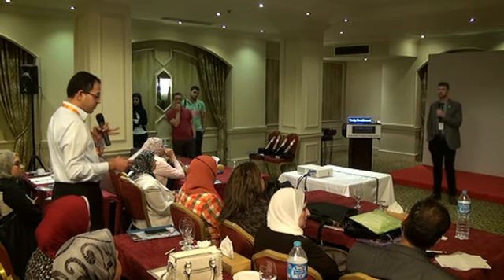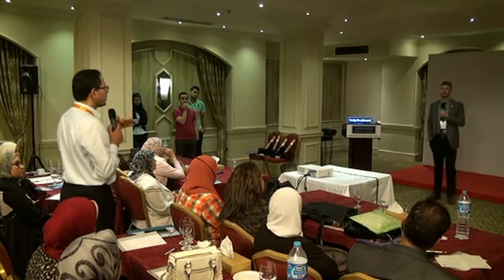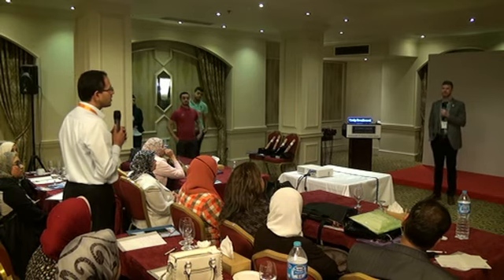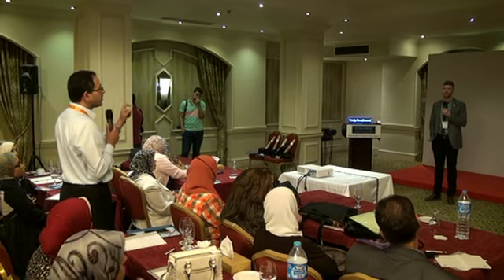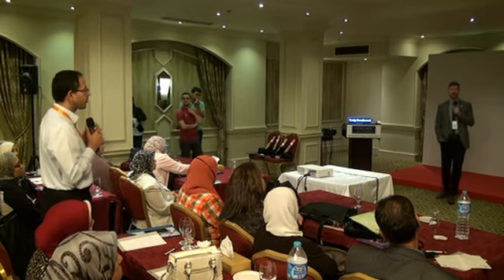Thank you. The second thing about capnography, even end-tidal CO2, you didn't show us the effect of leaks on this. When we are using capnography in the neonatal population, we have many leaks. What does a leak do to the accuracy of end-tidal CO2? I think it will make the correlation poorer or make the gradient greater. Yeah, that's a good point. I did definitely skip over that, so thanks for asking that important question.